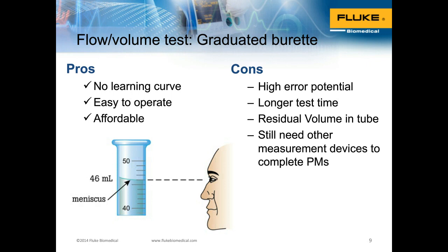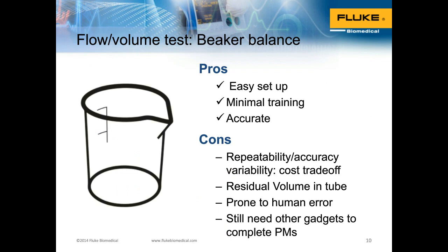The same is true for the beaker balance method as well. It's very easy to set up. It requires minimal training. It's reasonably accurate, but most scales, by the way, where in this case you're actually measuring the weight of the fluid, are really rated for repeatability, not accuracy. So be careful when you do that. Those repeatability ratings, depending upon the type of scale you have, could be 10 to 20%, as high as that. So depending upon what the requirements are for accuracy, when you're selecting the scale, always be careful to note exactly what the accuracy of that scale is, not the repeatability.